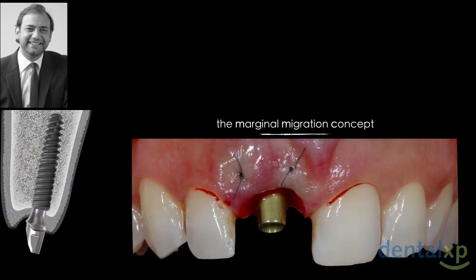Now, we heard yesterday that our surgery has nothing to do actually in this scenario with a single tooth implant surgery with the papillas. We know that this papilla belongs to the lateral and the mesial papilla belongs to the central incisor.